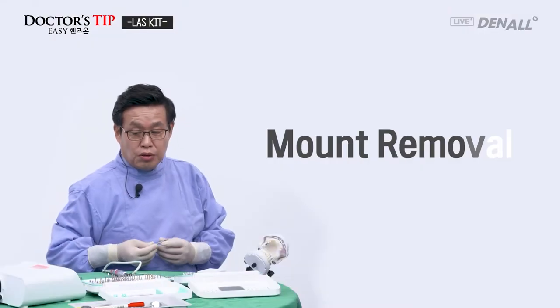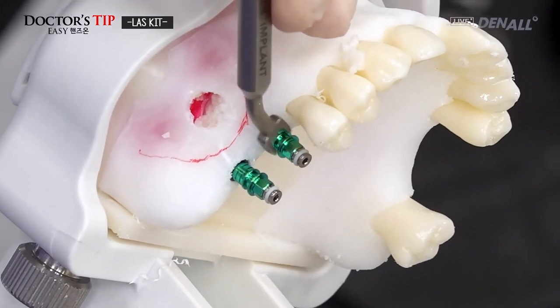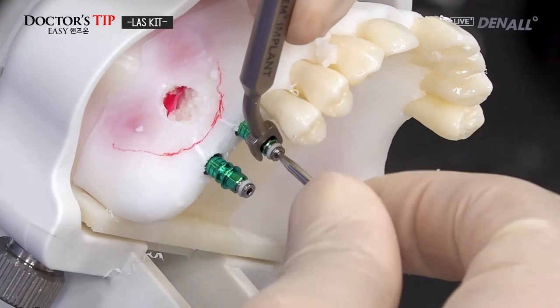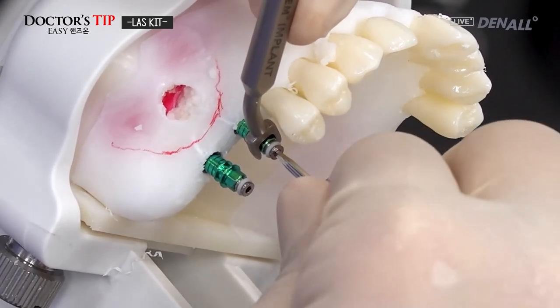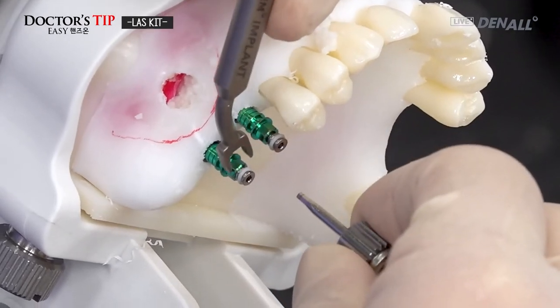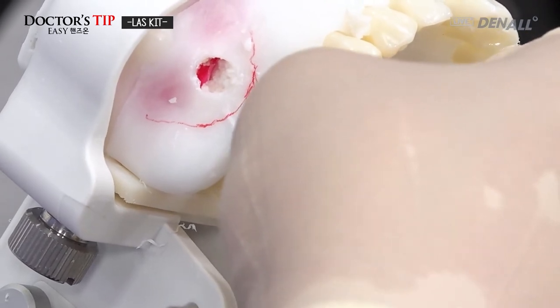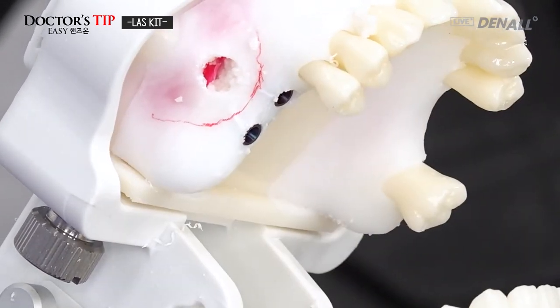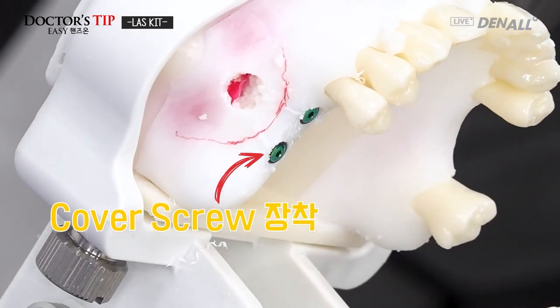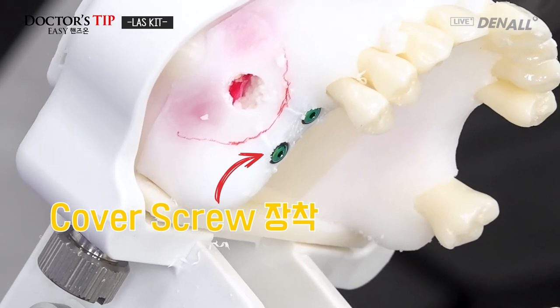Then the pre-mount will be removed with the open wrench, because if stability is weak, it can get loose. So like this, you loosen it, and same for this one also. And you put in the cover screw, then implant placement is complete.